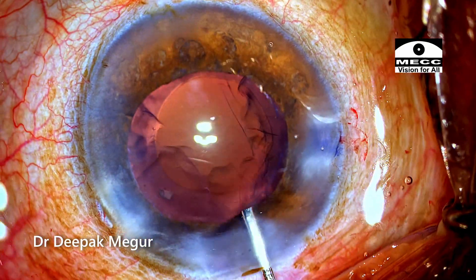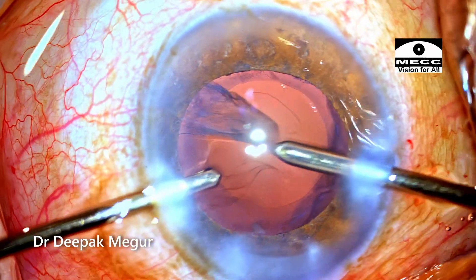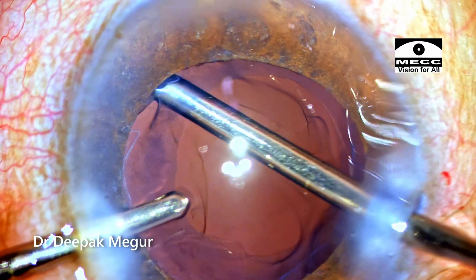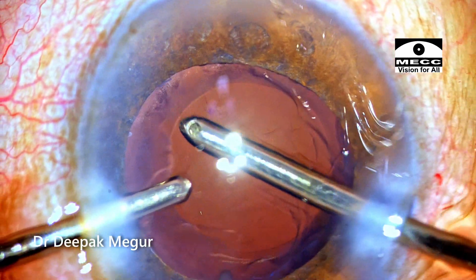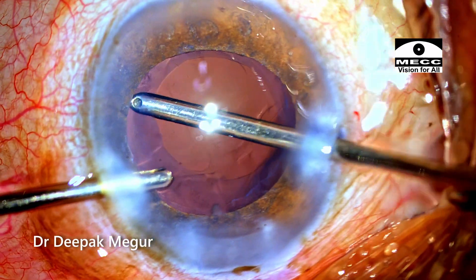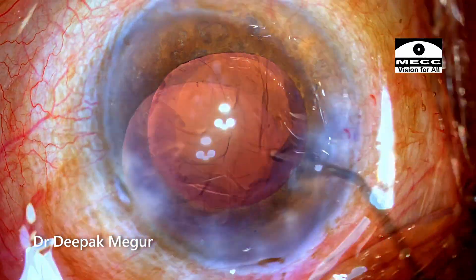Time to aspirate the cortex. During cortex aspiration, there is a hint of localized zonular dehiscence at this location. It doesn't appear to be very large, thankfully. Not much cortex is remaining, so it is time to implant the capsular tension ring (CTR).